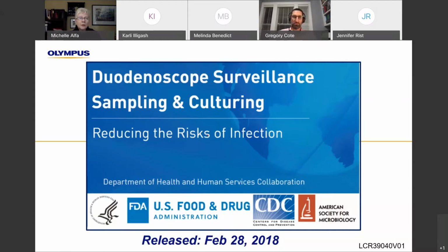So as you're contemplating, and I think all the points that we've made clearly spell out the pros and cons of what culture can and can't do for you, keep in mind that there are a lot of centers that probably don't realize whether or not they have any contamination in their scopes. And as a periodic process and part of a quality assurance program, I think it is good to at least have some idea of whether you do have endoscope contamination going on or not. And the frequency with which that can be done is something that has to be thoroughly considered before starting actually doing it on a more regular basis.